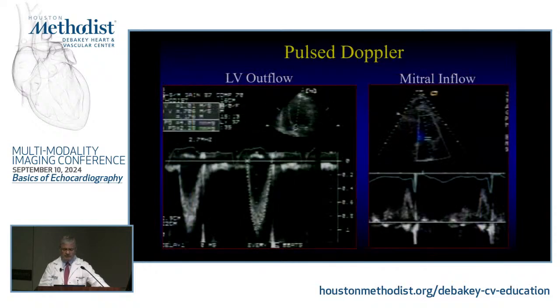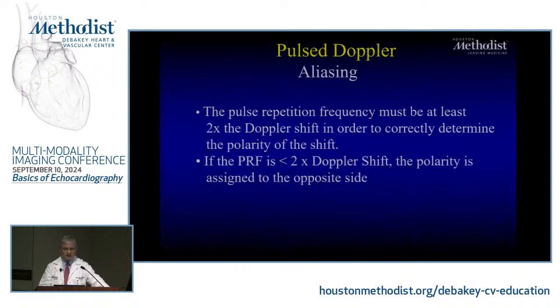Okay? And then you have a mitral inflow. You could see it there. And I'm assessing where that velocity is. There's a phenomenon of aliasing since I use a pulse, then I have to wait. Just imagine if the structure is further and further and further away, I have to wait longer. So if the velocity is much higher, the frequency is much higher, I may not be able to solve it.